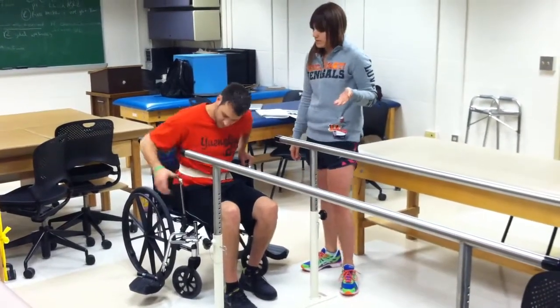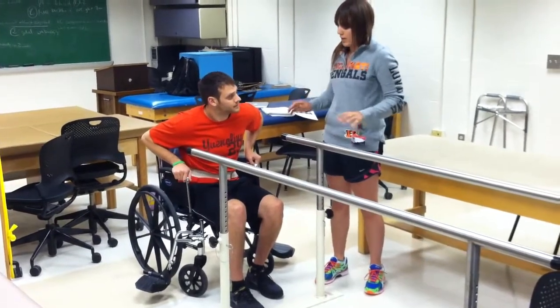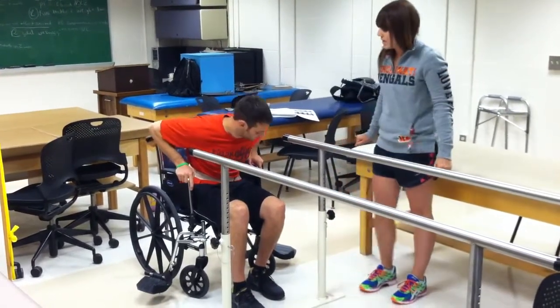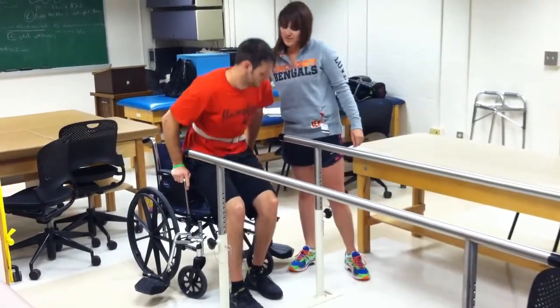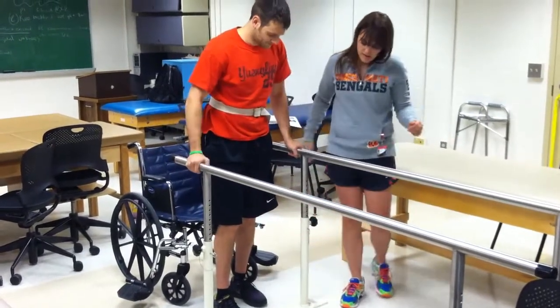Put your hands on your armrests. As you're pushing up, when you feel like you can, go ahead and stabilize yourself on the parallel bar so that you can fully extend to standing.